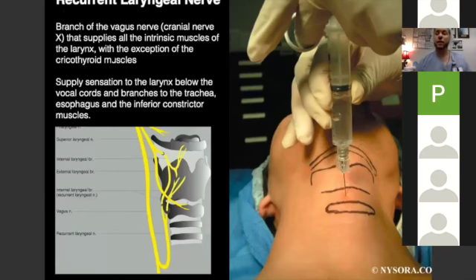Now that is the ninth nerve and the superior laryngeal nerve. Now let's talk about the recurrent laryngeal nerve. Now there's a lot of techniques. I know Mekian likes to put an epidural catheter through his fibroscope, and when he sees the trachea, he advances it down the trachea and squirts through the epidural catheter to get the recurrent laryngeal. That's one option.